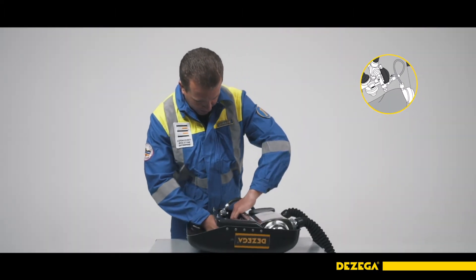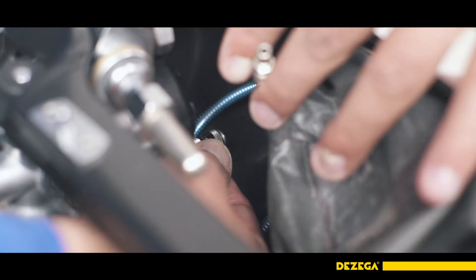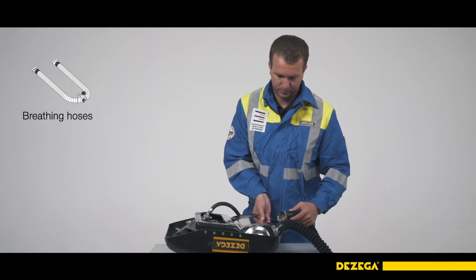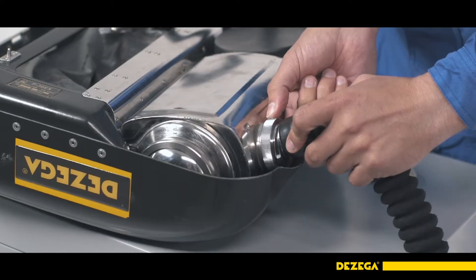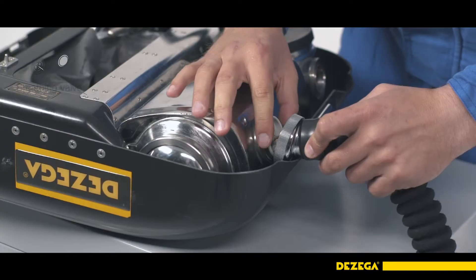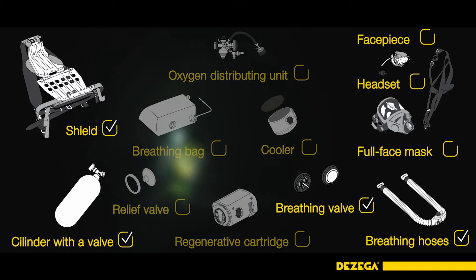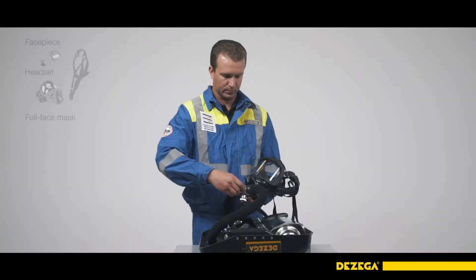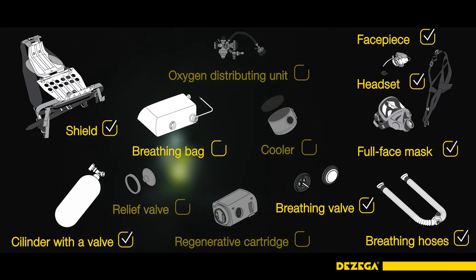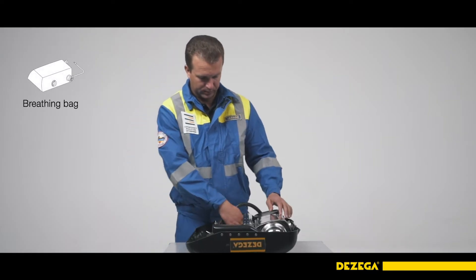Disconnect the breathing bag from the oxygen distribution unit by manually unscrewing the two nuts. Disconnect the no-oxygen signal device pipe fitting from the T by pulling the clip toward the oxygen distribution unit. Disconnect the inhalation and exhalation hoses from the cooler and the absorbent cartridge respectively. Pull out the inhalation and exhalation valves from the cooler and the absorbent cartridge. Unscrew the special screw and disconnect the plug or the facepiece.